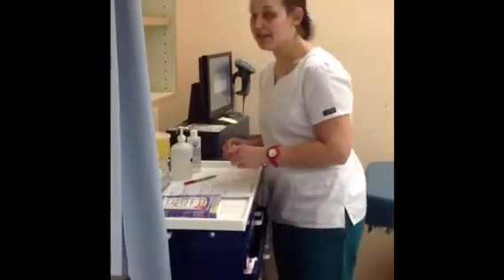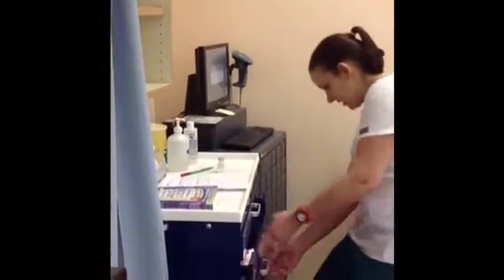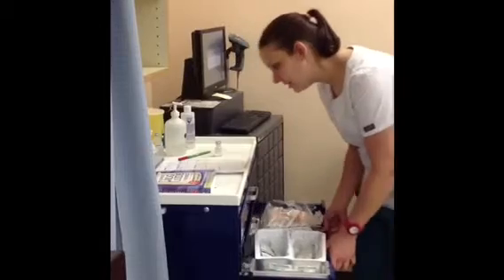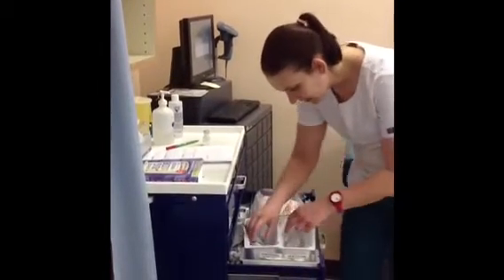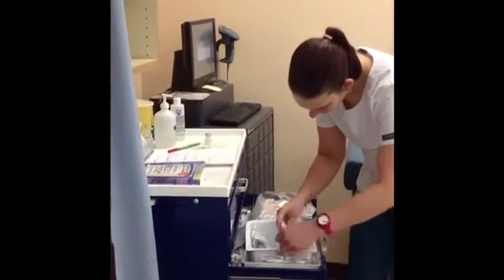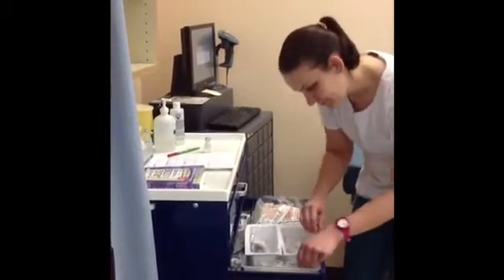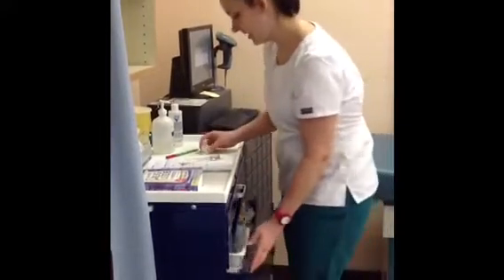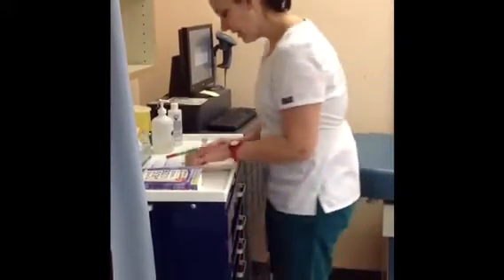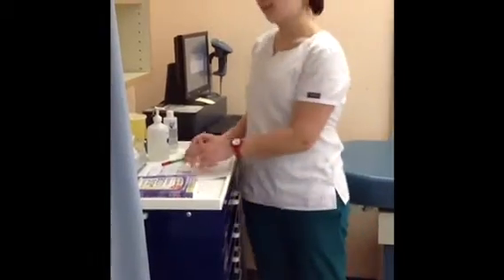I'm going to get my supplies. I need to get the needle. Let's see. I need a 27 gauge half-inch needle. Okay, so I have this needle, I have my medication, checked everything out, everything matches. I'm going to lock this up and I'm going to go prepare the medication to administer.